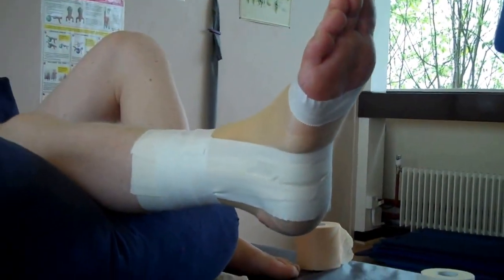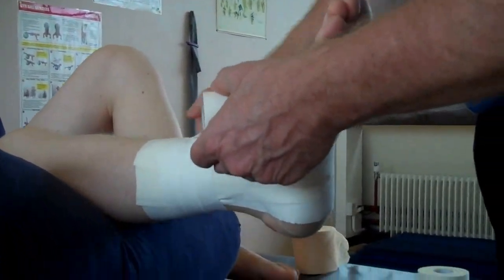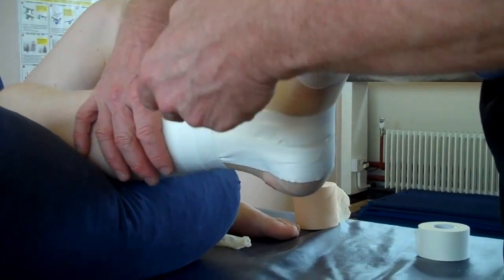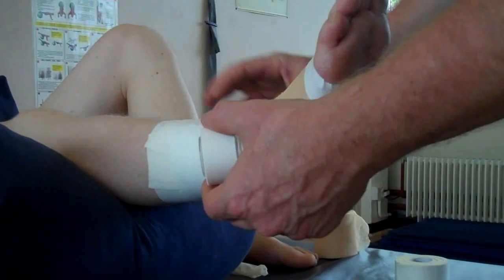On a smaller foot you can use the one-inch tape. If you've got a size 9, 10 or larger, you'd probably want to use the one-and-a-half inch zinc oxide.